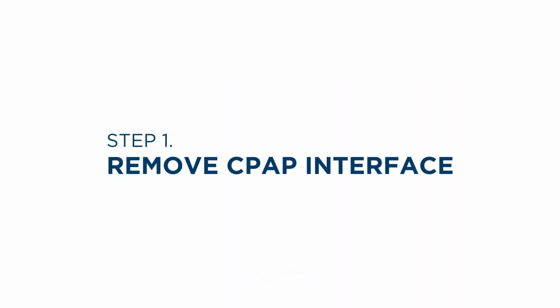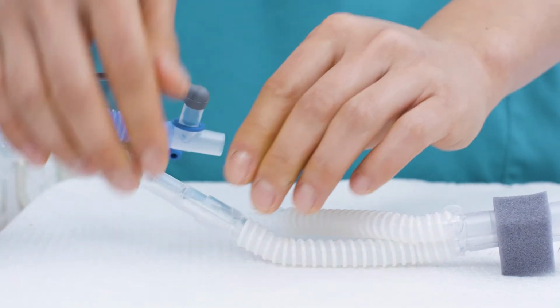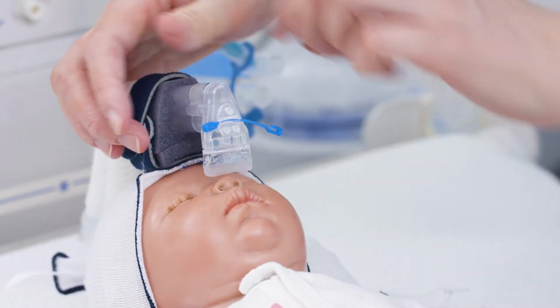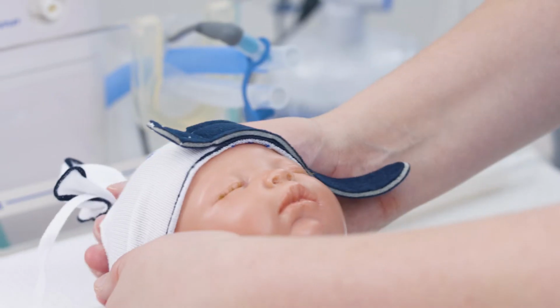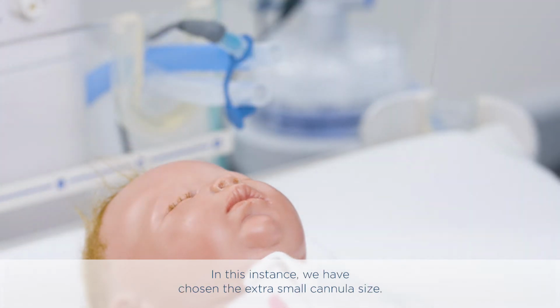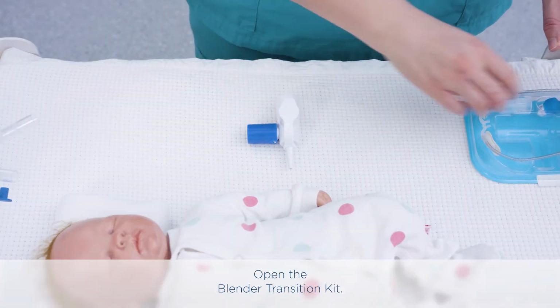Initial setup. Remove CPAP interface. Setup. Select appropriate cannula size. A visible gap should be seen around the prongs. In this instance, we have chosen the extra small cannula size. Open the Blender Transition Kit.